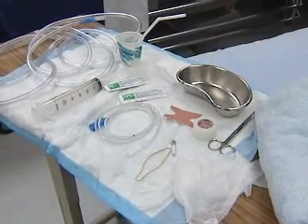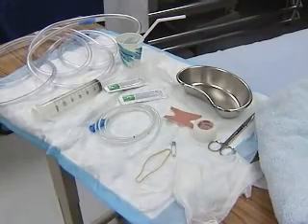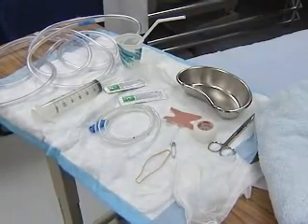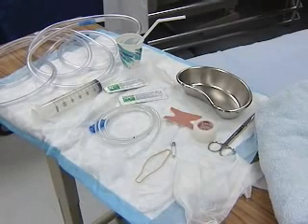You'll need 14 to 16 French gauge nasogastric tubing, water-soluble lubricant jelly, catheter tip syringe, a suction drainage system, and hypoallergenic tape.